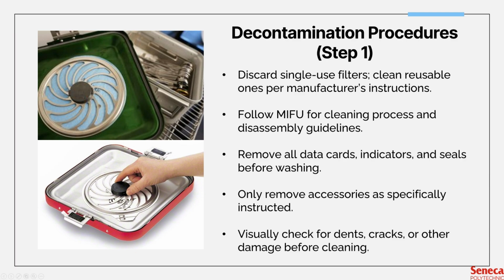In one of the hospitals I worked in, it used reusable filters like this one, and how we kept track of the number of uses is by adding a barcode on it. Every time we receive it in assembly, we would scan it, and that would add a use to its number of uses.